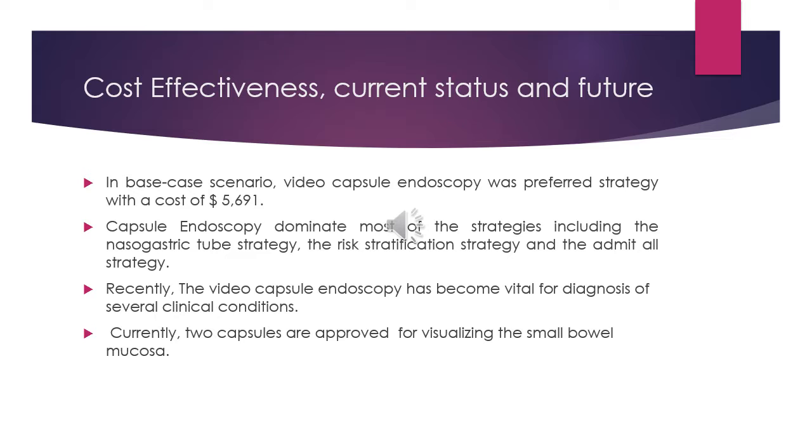Established indications for video capsule endoscopy include unexplained gastrointestinal bleeding, small bowel Crohn's disease, localization of small bowel tumors, and a broad range of miscellaneous abnormalities.